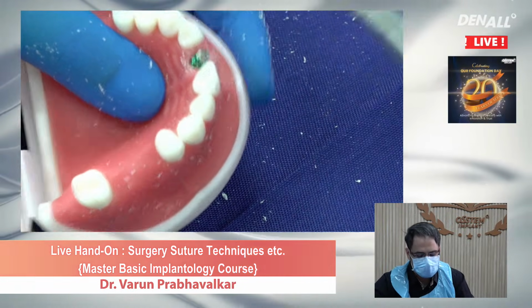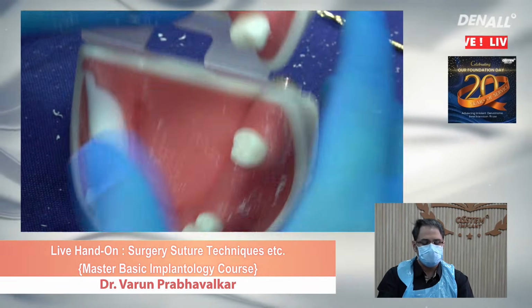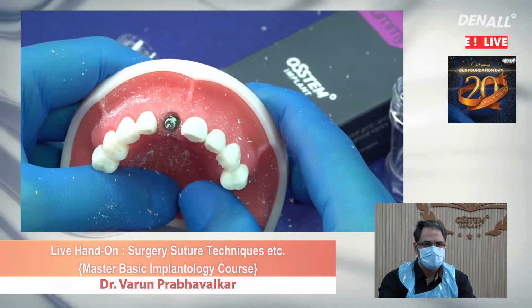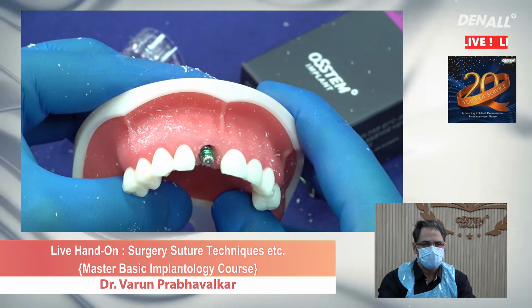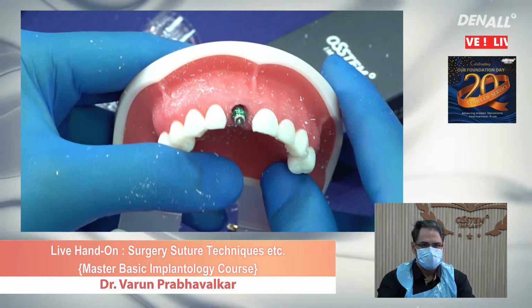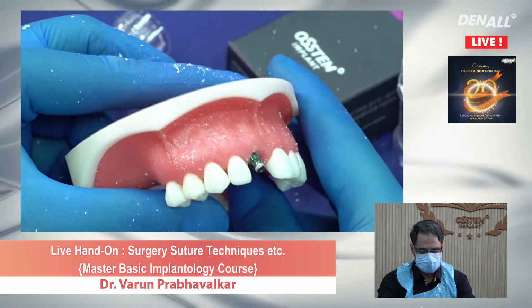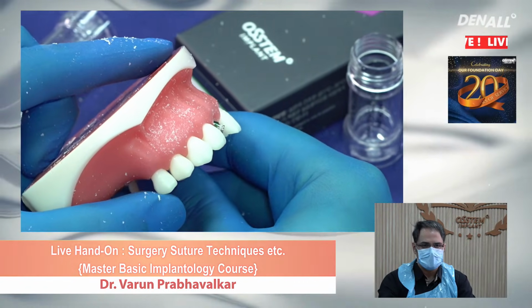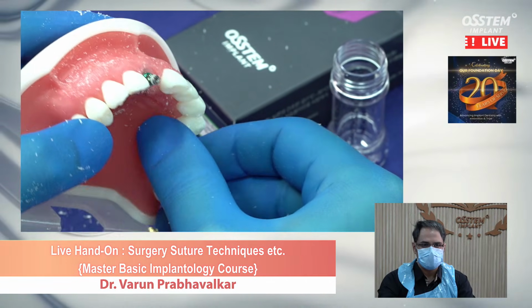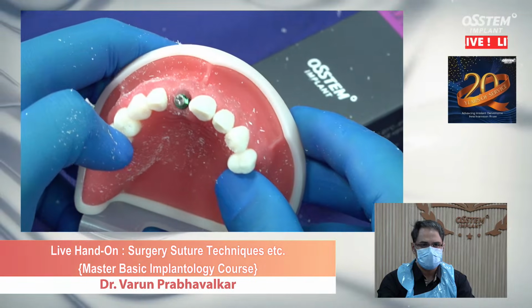Submerge the implant. I've got the stability, and this is what we have as our implant placement. Now our mount is telling us what can be the angulation for this. There you go. Over here you can use a straight abutment later, and put a cement retained crown.